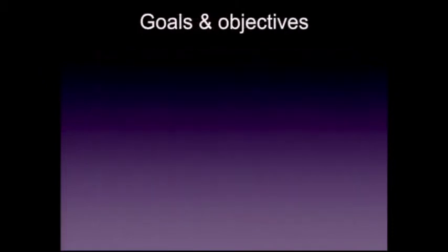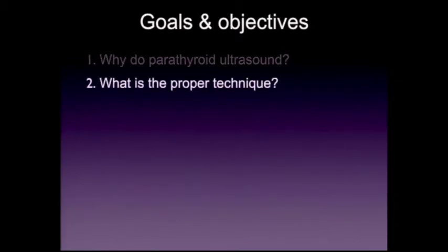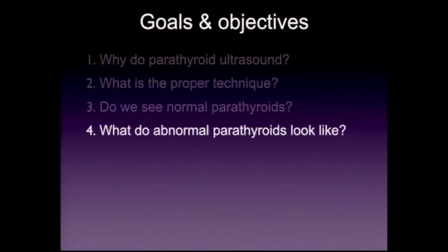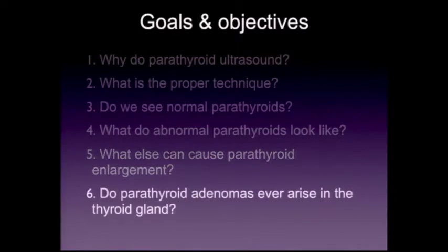Here are my goals and objectives for this presentation. Starting off, why do parathyroid ultrasound? What's the proper technique? Do we see normal parathyroids on ultrasound? What do abnormal parathyroids look like? What else can cause parathyroid enlargement? And do parathyroid adenomas ever arise in the thyroid gland?